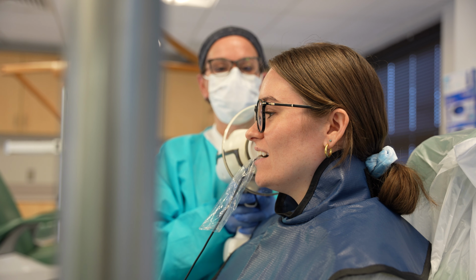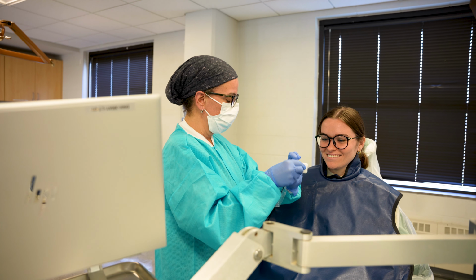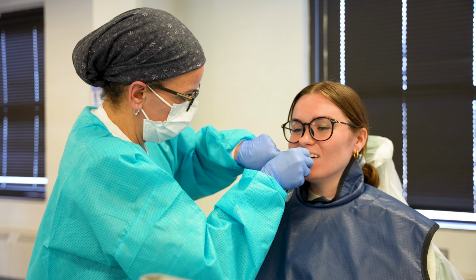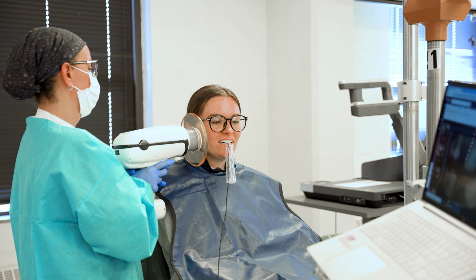The Nomad is a handheld X-ray device. It allows us to take intraoral images on our patients, X-ray images on our patients with dramatically less radiation. It is safe for both the patients as well as the clinician. We no longer have to be in the traditional dental chair setting with the arms and all the equipment that comes with it. The Nomad allows us to take our equipment and go on the road and treat patients anywhere.